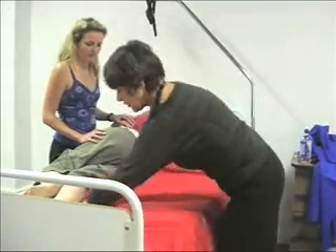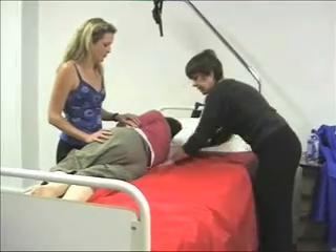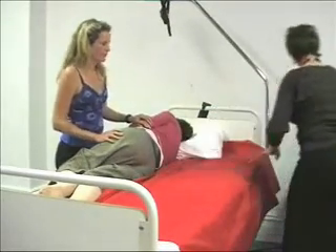The slide sheets are inserted one at a time, pushing them under the buttocks first, then heels and shoulders, and under the pillow so that the whole body is supported.